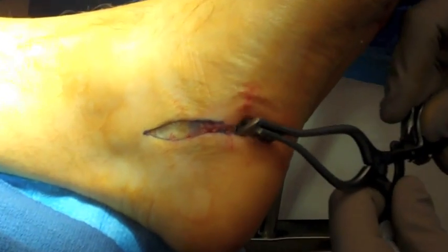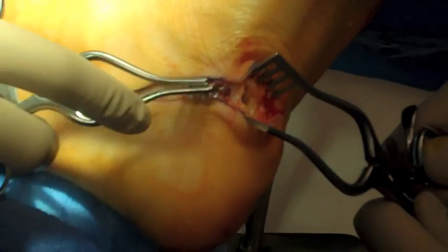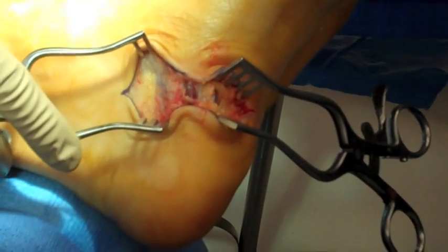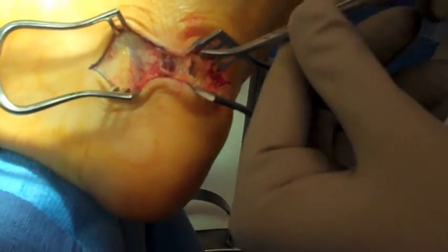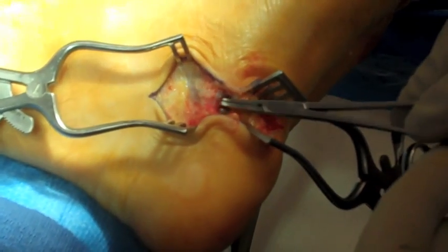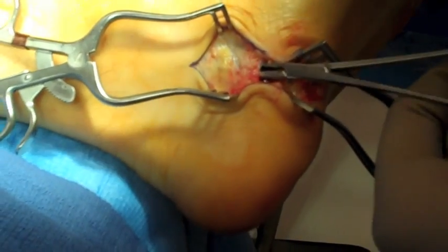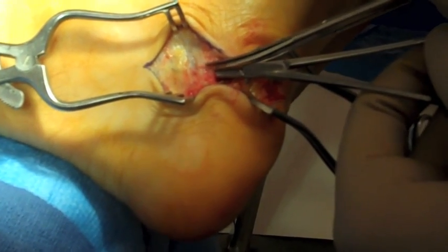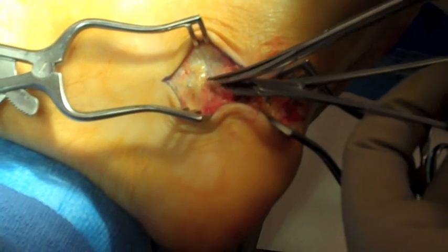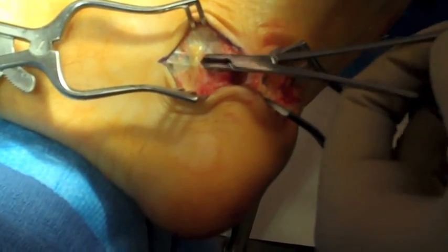Wheatlaner retractors are then inserted into the surgical site to expose the area, both at the most distal and proximal aspects. The abductor muscle belly is visible beneath the deep fascia. Hemostats are used to elevate the deep fascia off the abductor hallucis muscle belly and to free the tissue. This is a safe method to release the deep fascia without injury to the underlying muscle belly.